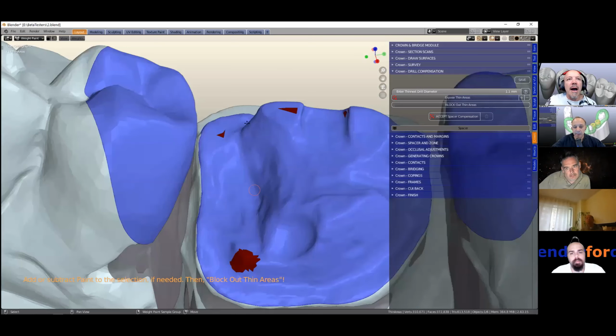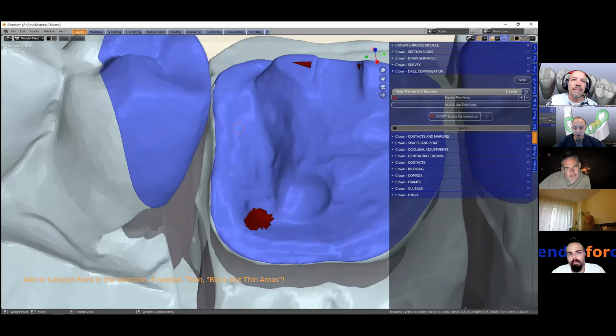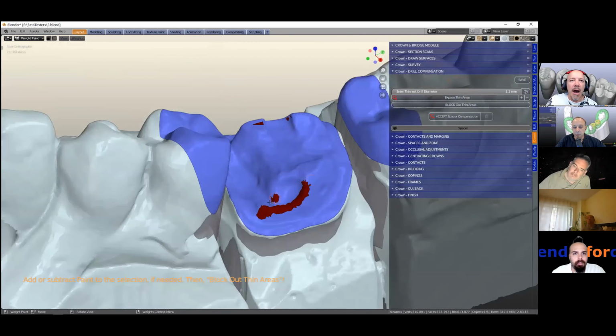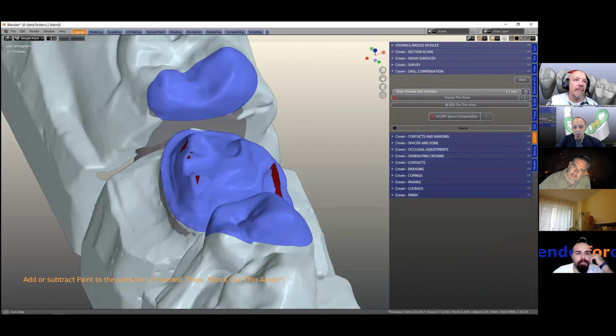Typically in a lab situation, those sharp ridges, I would have taken wax or something and just run a bit over, or composite, when we're preparing dies. That's 100% correct, because if this was a die in the lab, I would definitely block it out.